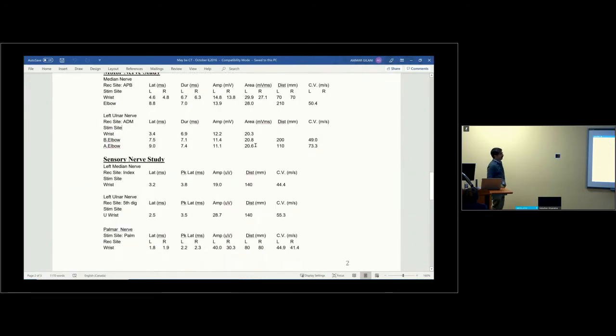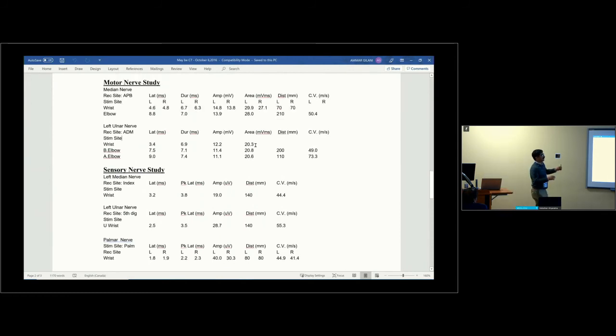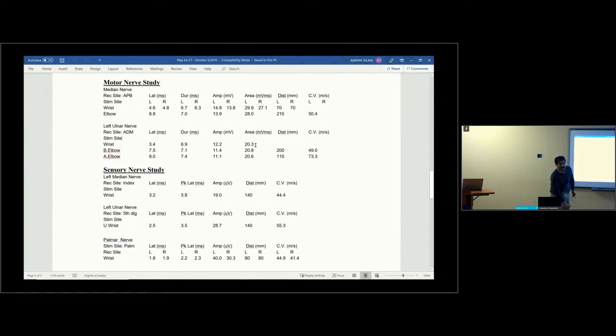When I look at the numbers, they will be all mumbo jumbo to you guys, but I wanted to show this because EMG is one test that is so much dependent on what you look at and who's doing it. If I'm looking at L5 radiculopathy and I don't do peroneus longus, I can miss it. Typically we do the needle examination of distal muscles, and if we see abnormality there, then we move upwards, right?